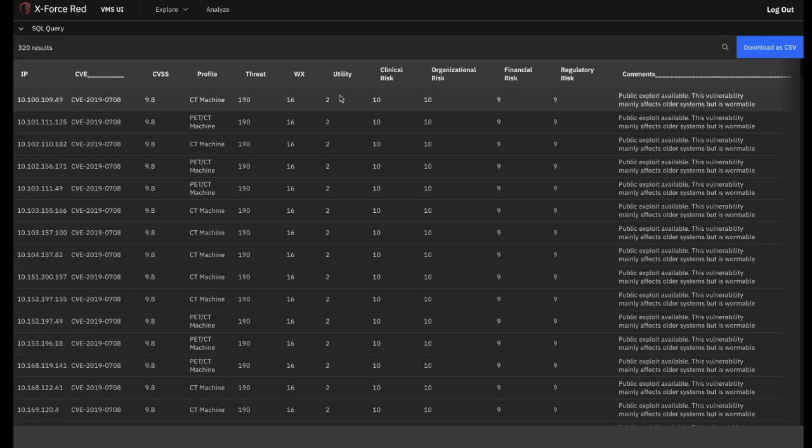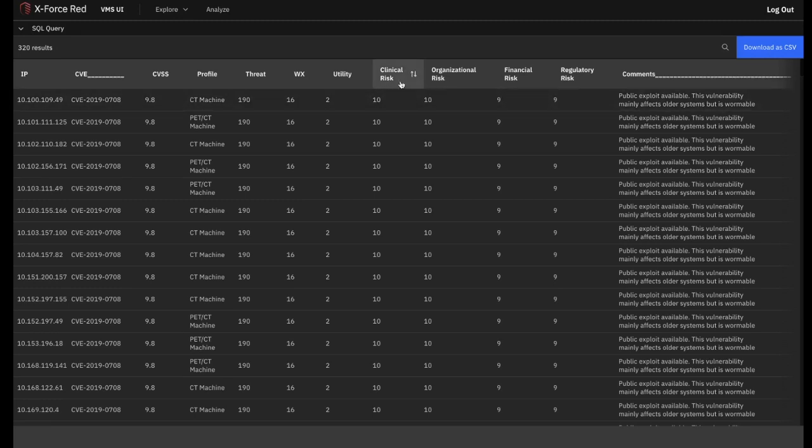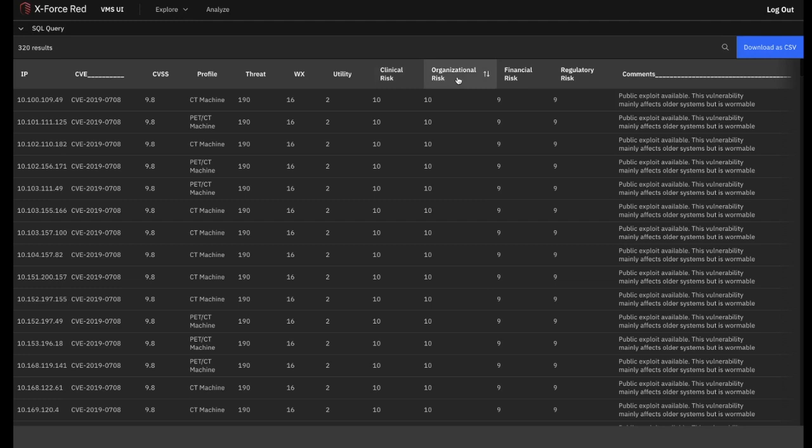Utility is another X-Force Red metric based on a scale of 0 to 2 that explains both how likely and how devastating exploitation of a vulnerability is from a technical perspective. In this instance, a score of 2 is the highest. Next, you have the CCOM2 analytics. As mentioned before, these are all scored on a scale of 1 to 12, with 12 being the most critical. Clinical risk represents the potential severity of patient harm that could occur if this particular vulnerability in this particular asset is exploited. Organizational risk represents the potential severity of clinical workflow disruption or service shutdown that could occur if this particular vulnerability is exploited in the context of its specific asset.